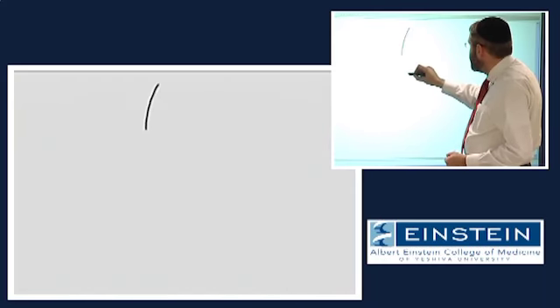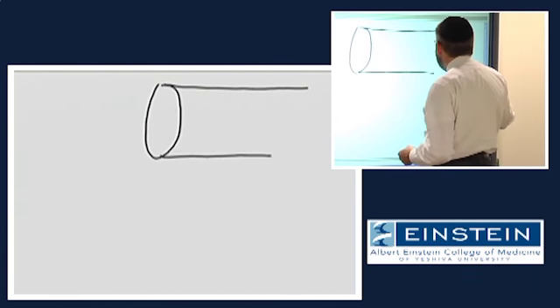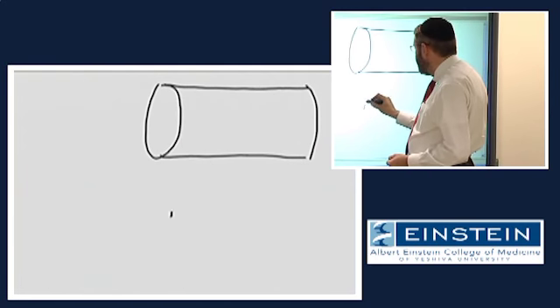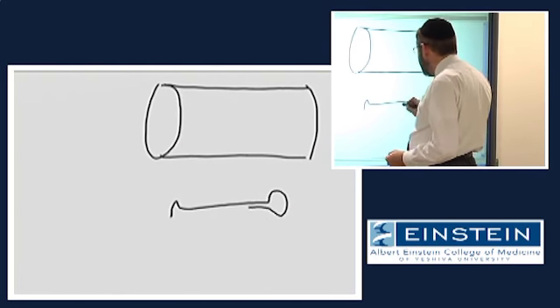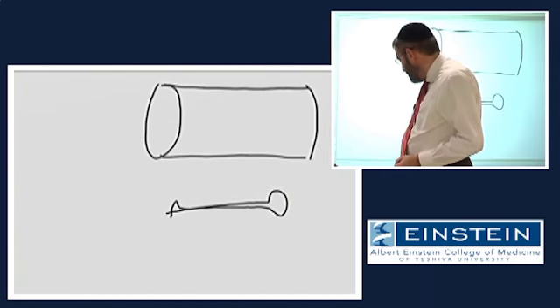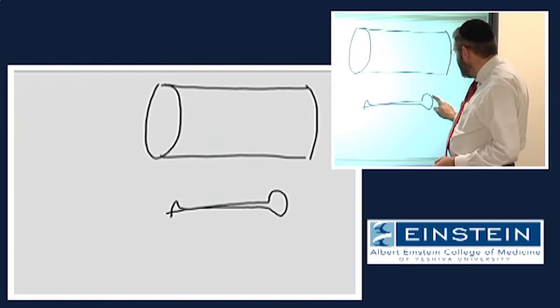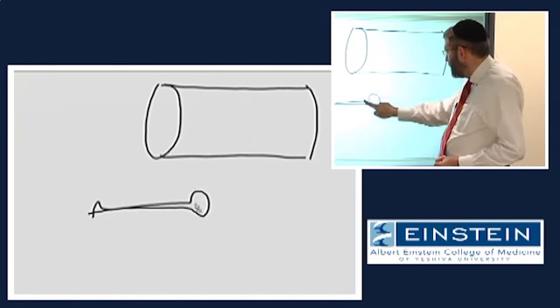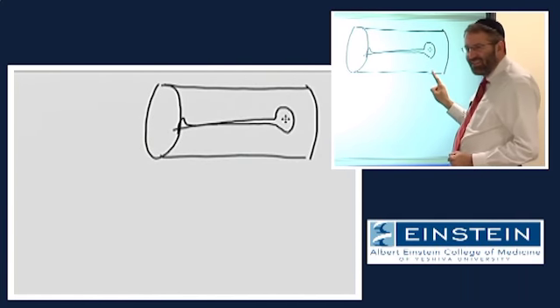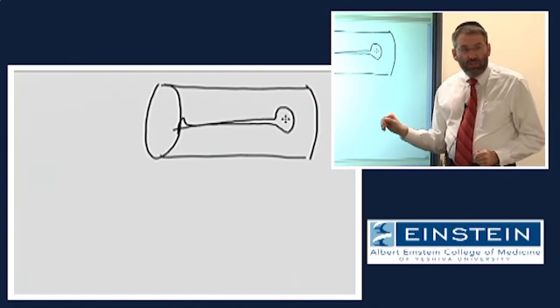We have this situation. Okay, so we take this patient, and we put them in like that. So we slide the patient in the scanner.